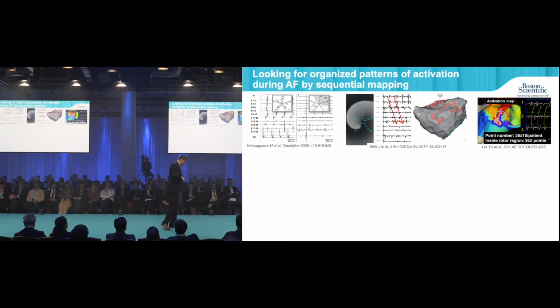We also have some data from the Taiwan group showing, with a very low-resolution sequential point-by-point mapping, some rotor sites. And ablation of those sites seems to be pretty successful.